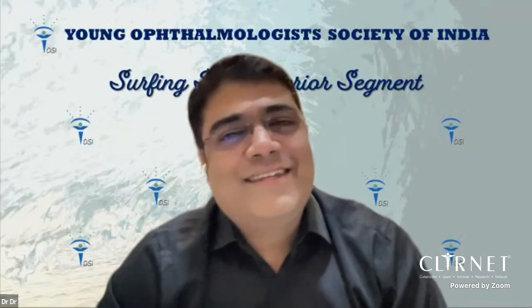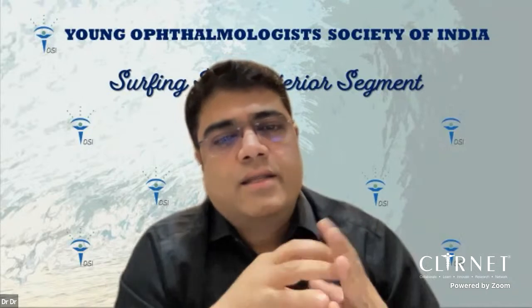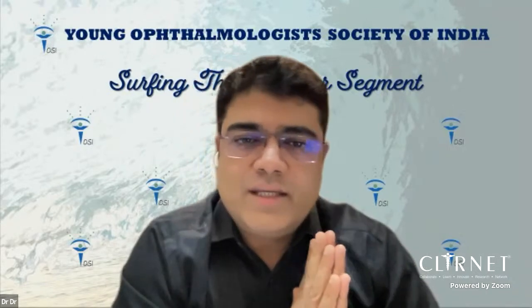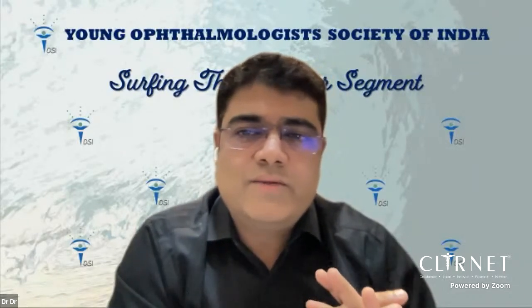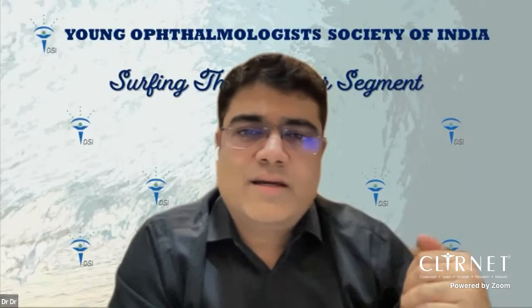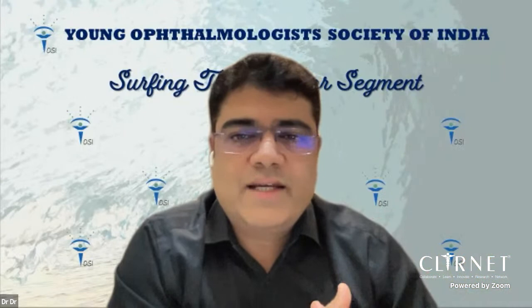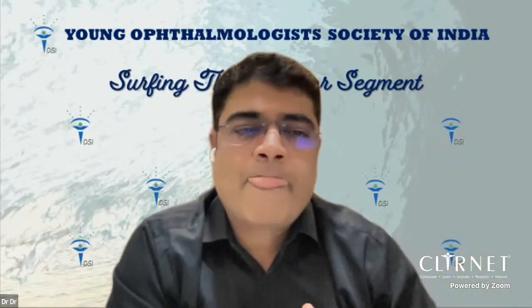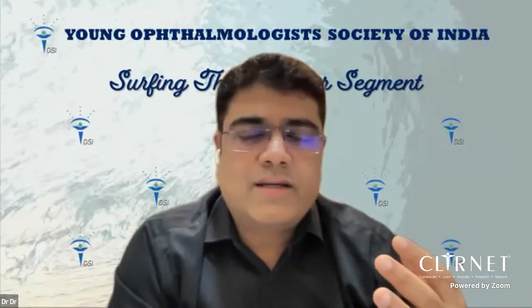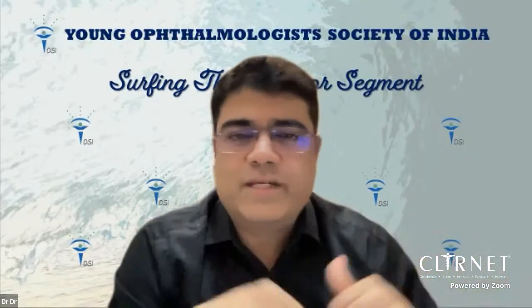See what happens, PCR is a known occurrence, but the problem only happens because of not handling it properly. Believe me, most litigations against surgeons have been because of not properly handling the PCR, and because of the complications related to retinal tears, retinal breaks, and retinal detachment. So never use these sponges and all these levitations. They are disastrous to the vitreous base.